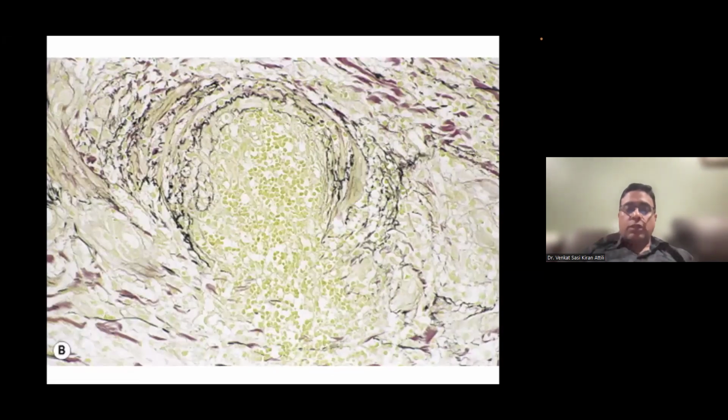Now, I mentioned it's sometimes difficult to differentiate a vein from an artery. We do that by doing an elastic Verhoeff-Van Gieson stain. When you do that, the internal elastic lamina is quite nicely visible. Though it is also present in the vein, it's not so thick.